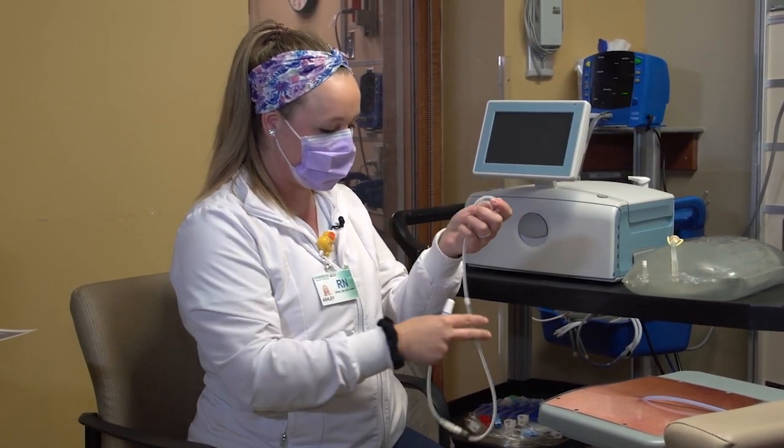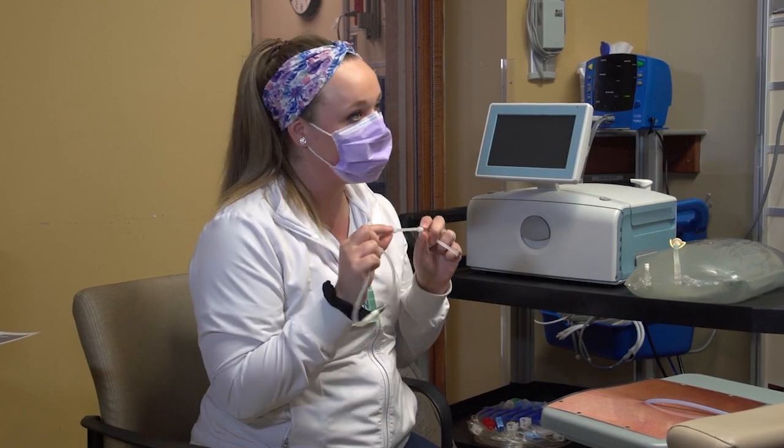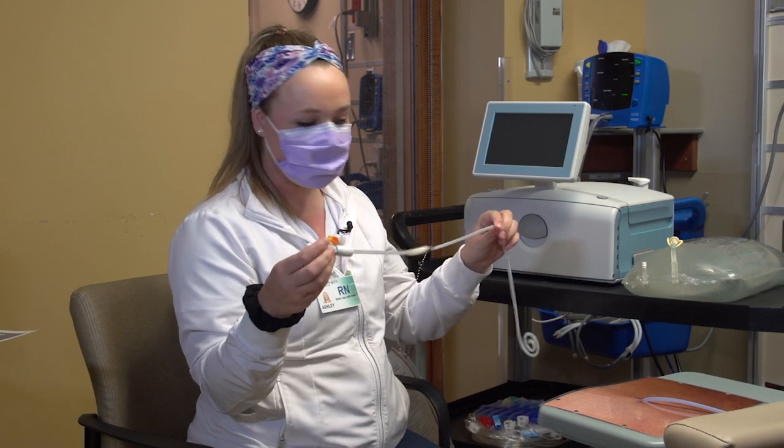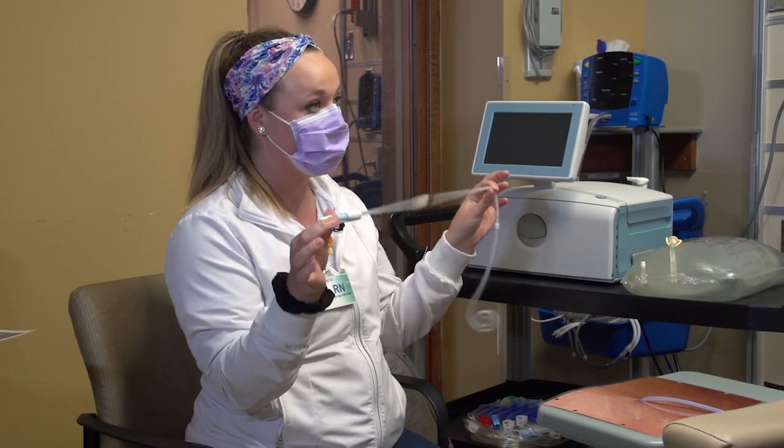It's got cuffs here to kind of hold it in place. And then this is about how much you would maybe see coming out of your abdominal cavity.